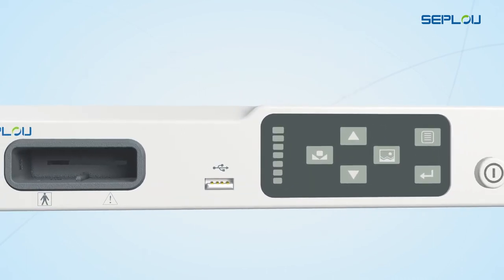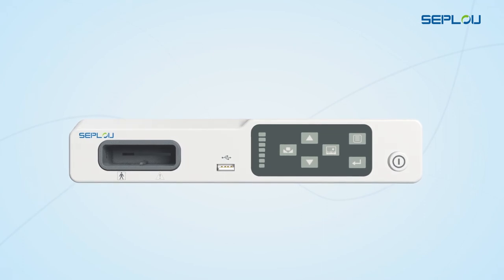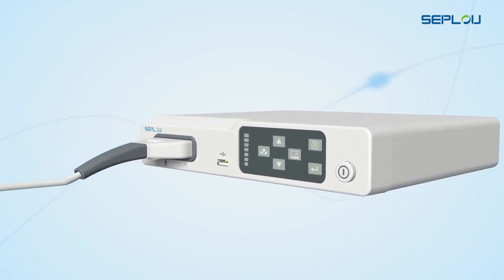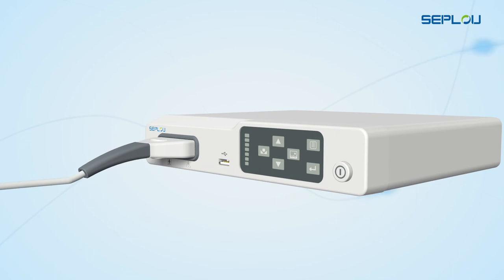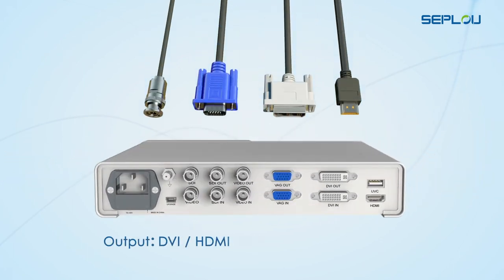The image processor supports Seplu's ureteroscope during minimally invasive surgery, provides power and processes the images for the endoscope. It can connect with your existing monitor and provides synchronous multi-interface output support.